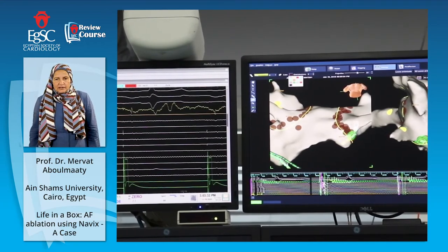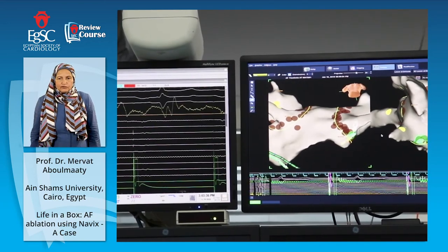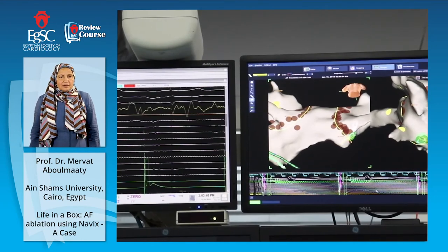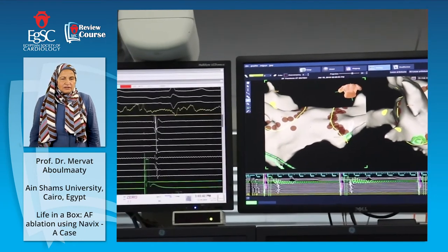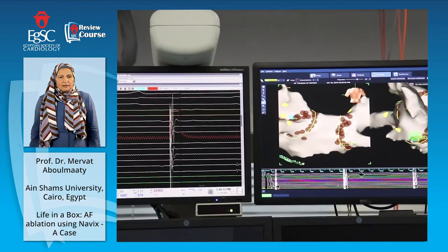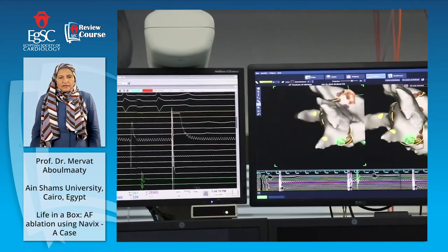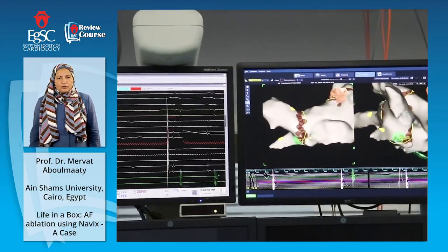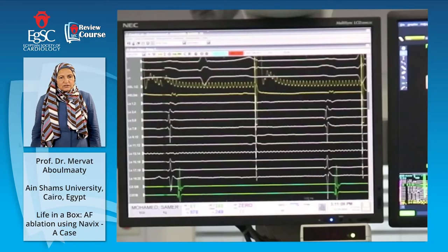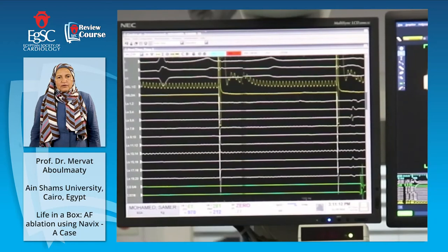We are in the inferior part of the right inferior pulmonary vein, outside the orifice, of course. And here you can see the potentials are gone on the ECG running in the Prucka. And if we look again, some dissociated potentials. After this, we are pacing and we are looking for any conduction. There is no conduction. This means that we ablated this right side vein thoroughly. Here is the screen. We are pacing.